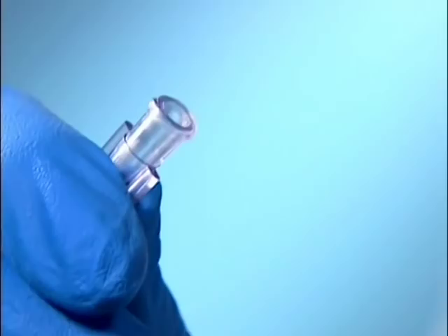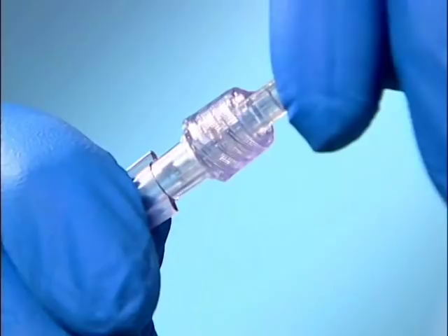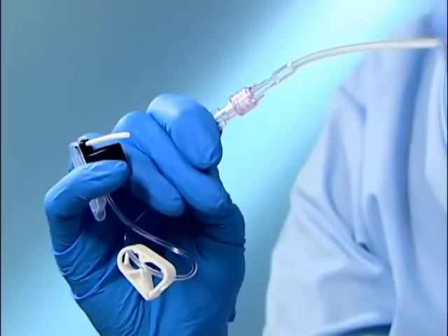Let me demonstrate for you. Prepare the site for placement of the Huber Pro. Remove the cap from the female lure lock adapter and attach the Huber Pro Set to the desired fluid source. Prime the set and expel the air.